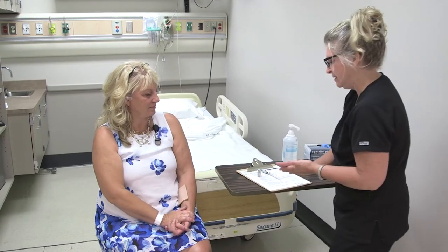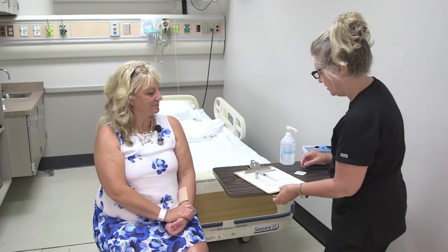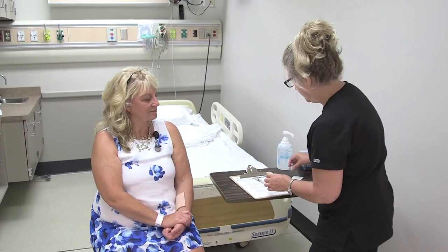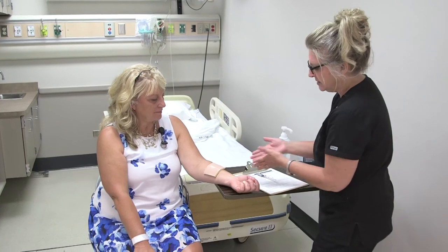'Do you have any allergies that you're aware of?' No. 'Very good. This injection will be given in your forearm — we'll use your left forearm. This is administered just underneath the epidermis, so I will not be putting the needle at a very large angle, probably about a 15-degree angle as I go in.' Now I'll go ahead and put my gloves on.